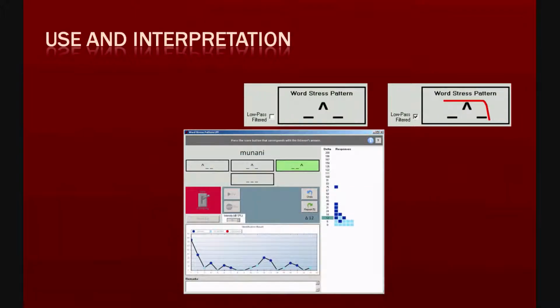How to use and interpret the test results. Since this test is fairly new, its use and interpretation still have to be explored. It is believed that the absolute value of the JND gives an idea of the low-frequency coding of the cochlea. Preliminary data show that listeners with normal hearing have JNDs of about 15 Hz on average.